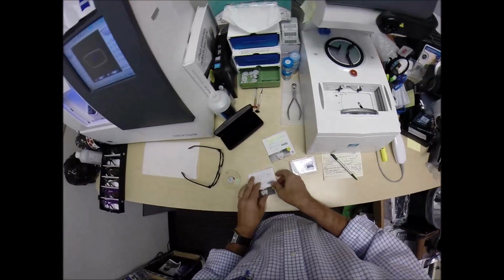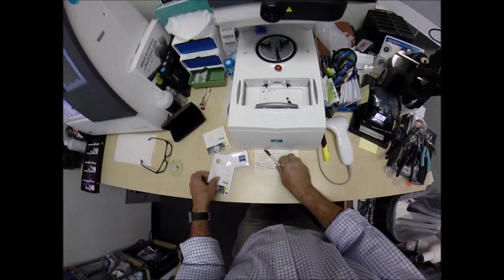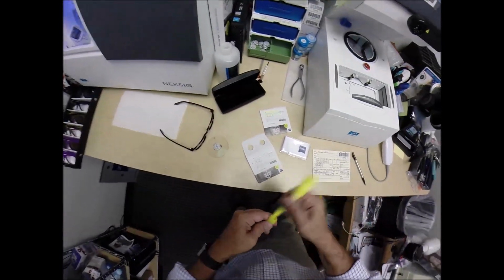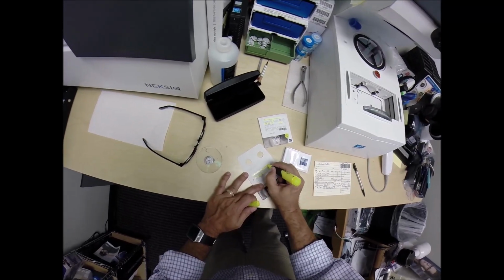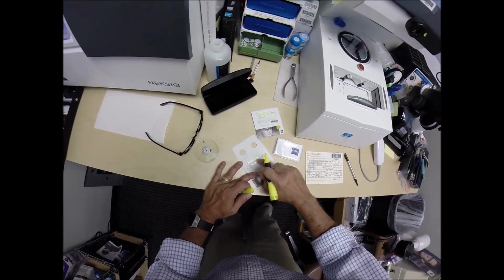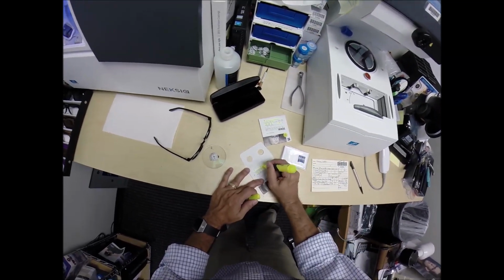And let's do the same thing now for the left lens. Take it out, put it onto the platform. The prescription reads +1 minus a quarter at 17. Again, this is the left lens, the Zeiss Progressive Light D 1.59, which is the refractive index of polycarbonate. PhotoFusion Pioneer Green with DuraVision Chrome.